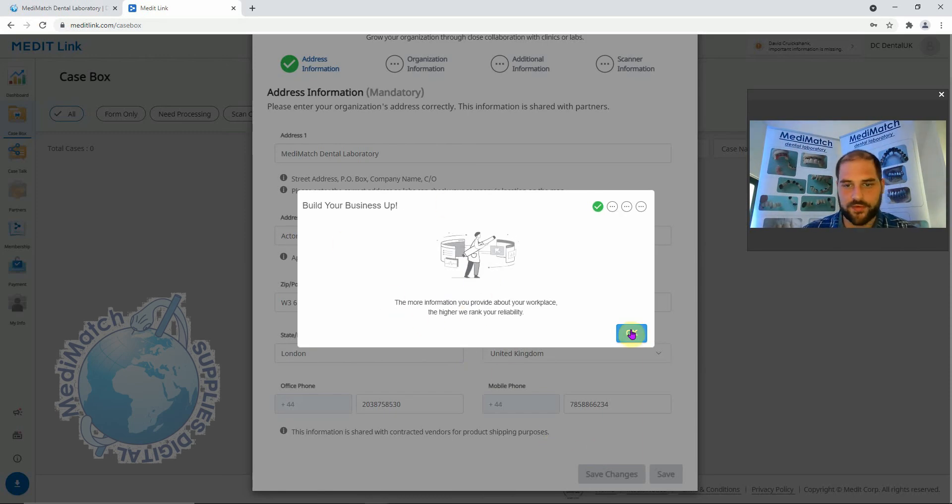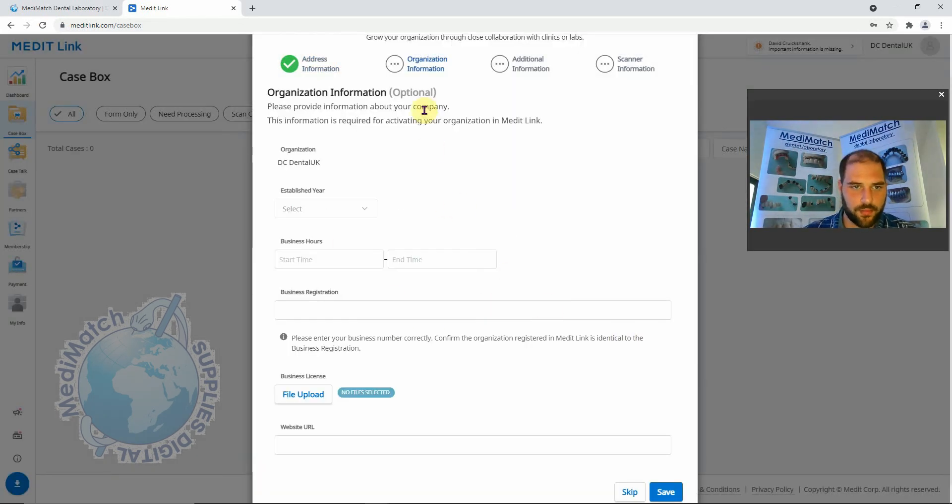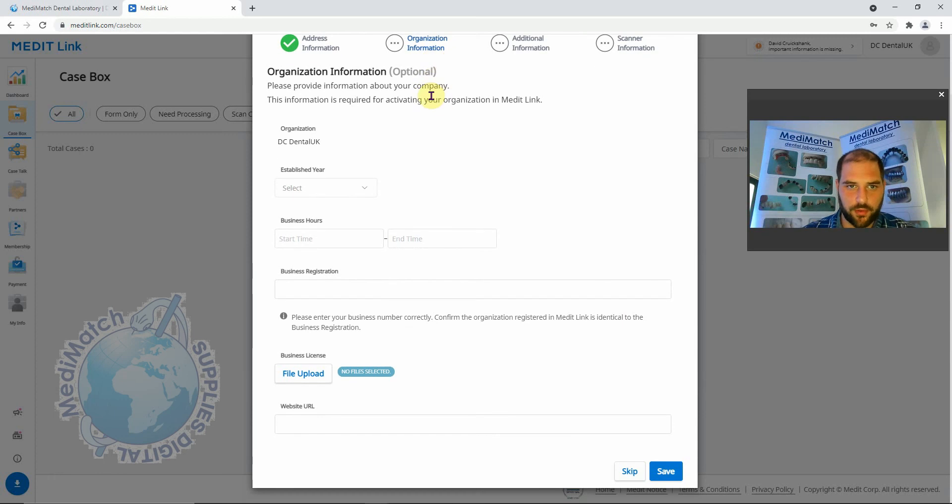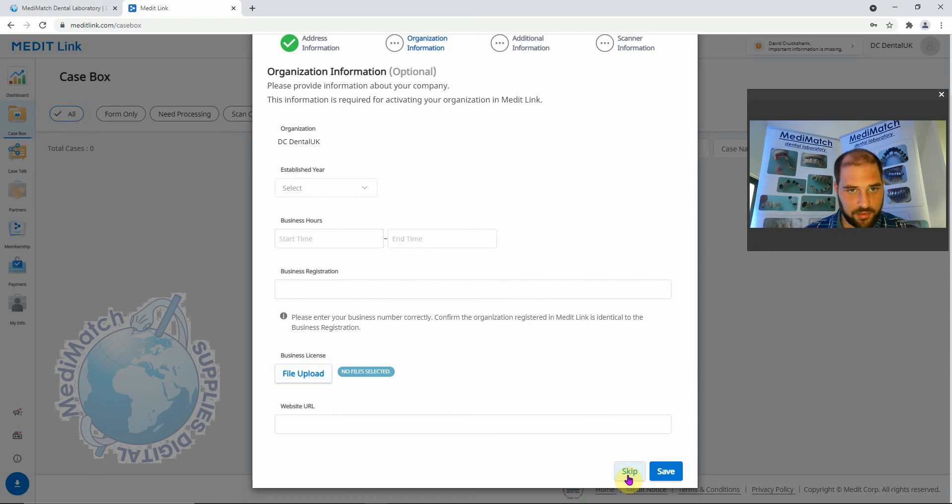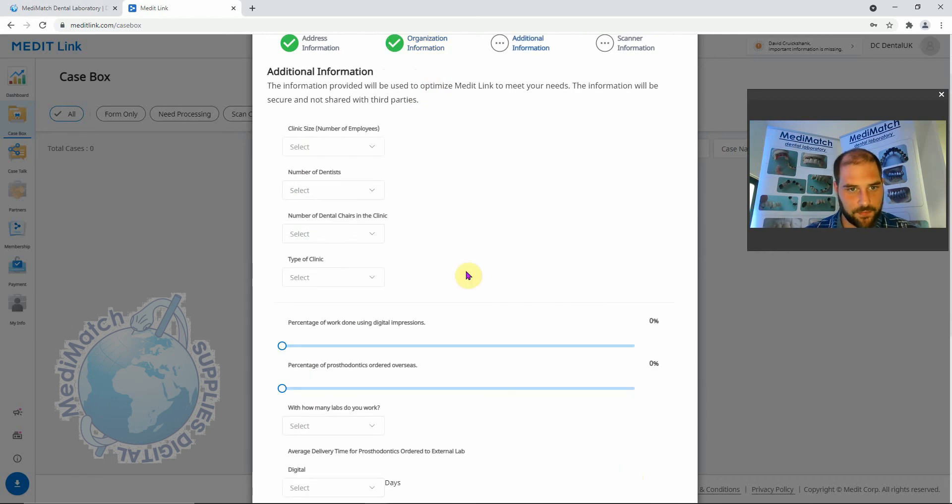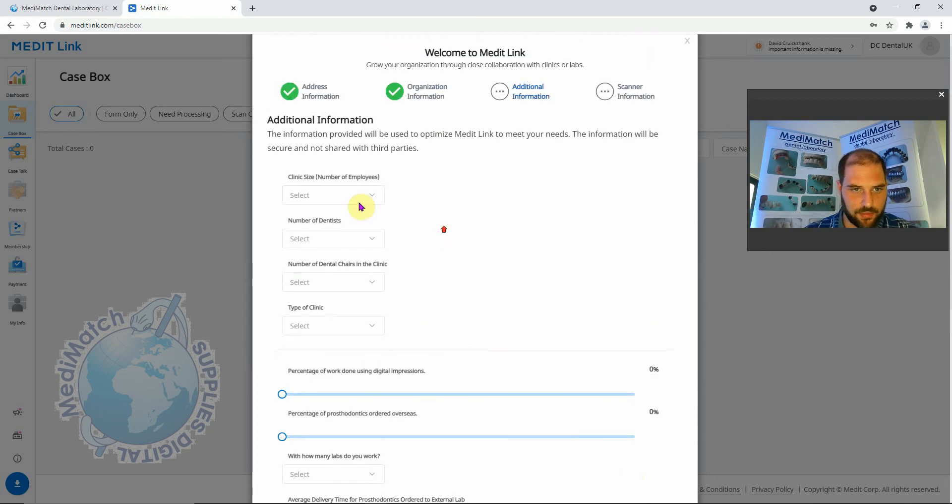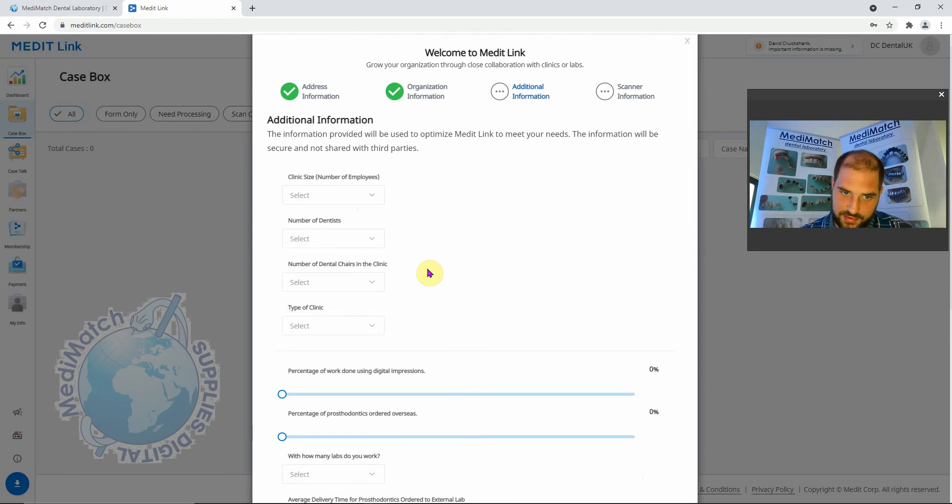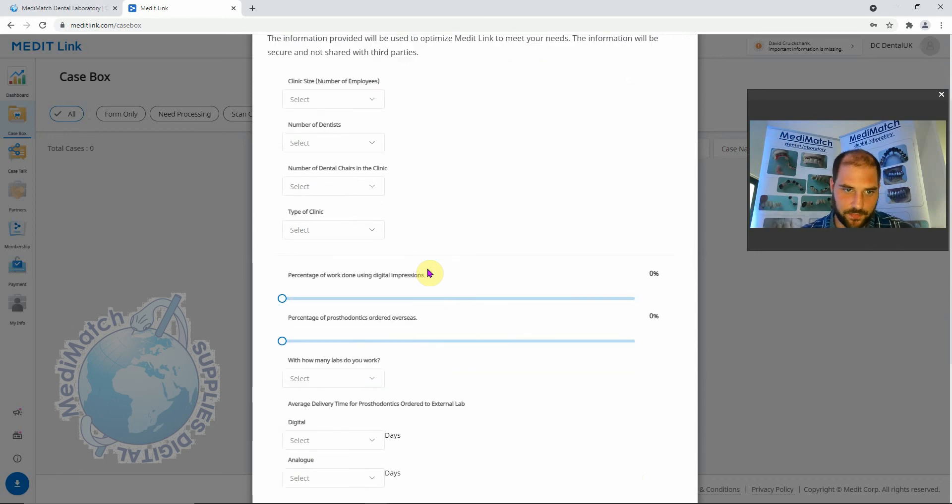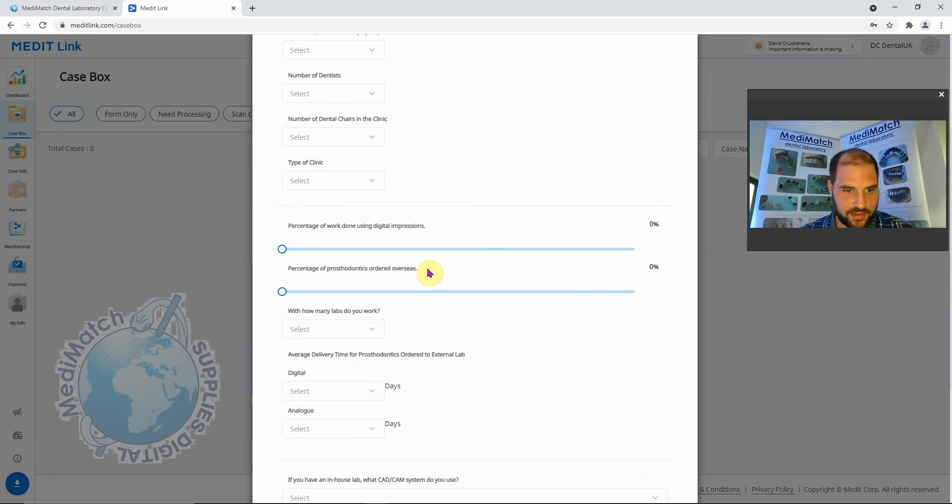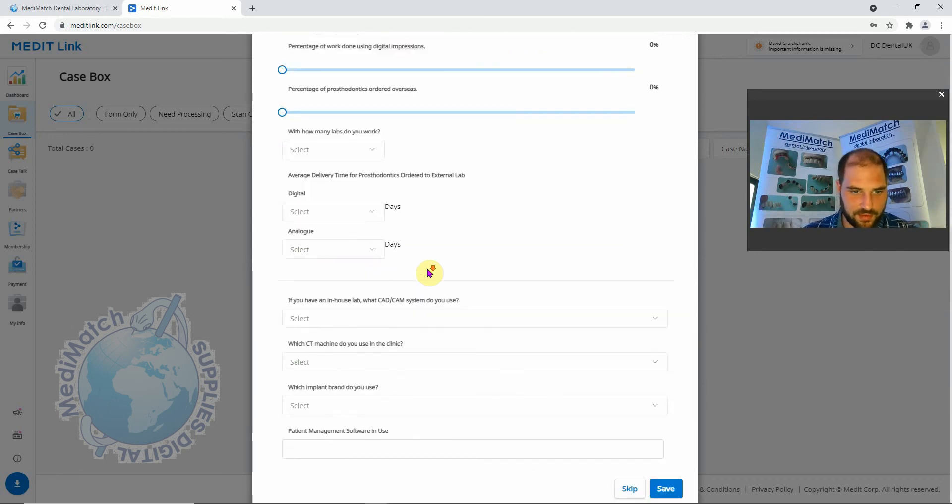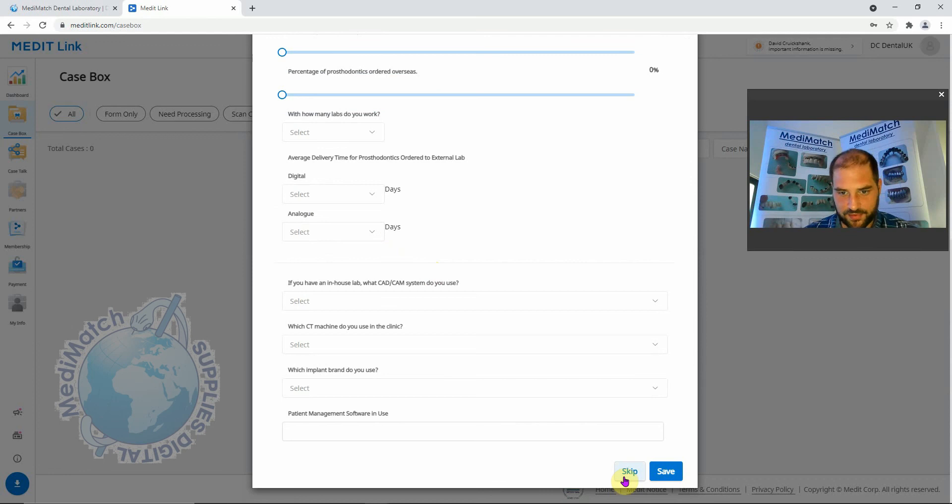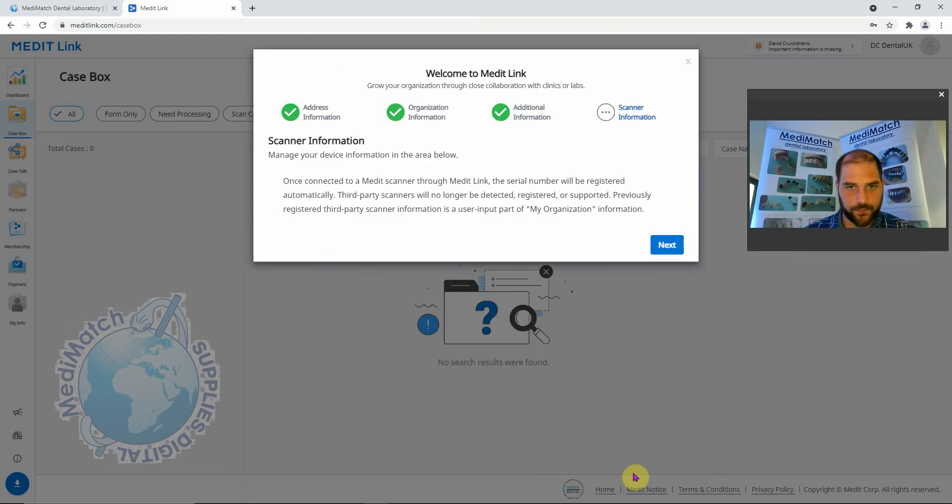They're going to ask you for some more information here. You can go in and fill in all this information if you wish, it's entirely up to you, or you can skip it. I'm going to skip it here. Same here, they want to know the size of your clinic, number of dentists, number of chairs, that sort of stuff. Again, more than welcome to fill it in, but I'm going to skip it for now.